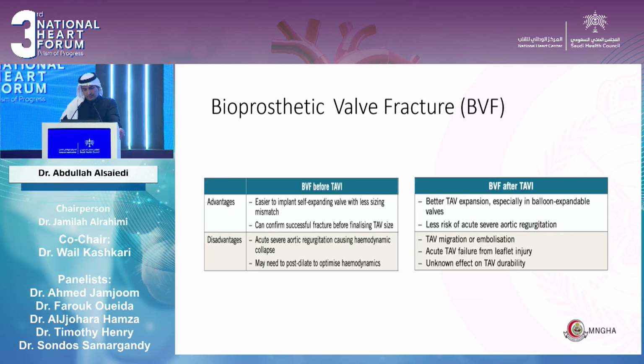So you could argue what could be basically the advantages and disadvantages of having the fracture done before TAVI or after TAVI. Every approach has its own pros and cons. Basically, going with balloon before TAVI has the advantages of easier implantation of a self-expandable valve with less sizing mismatch, and confirming successful fracture before finalizing the TAVI size.